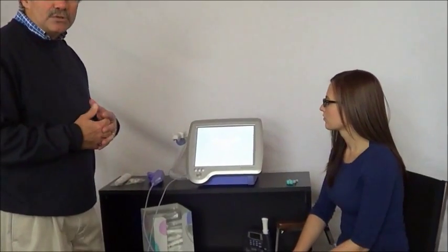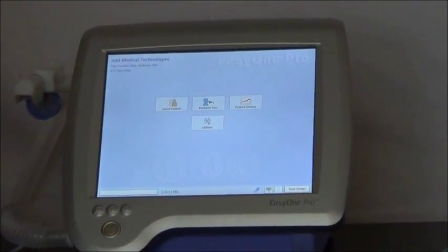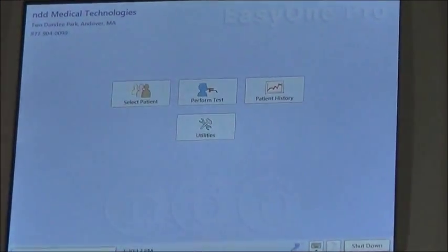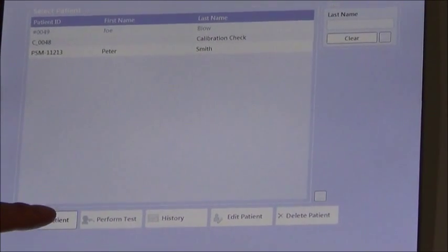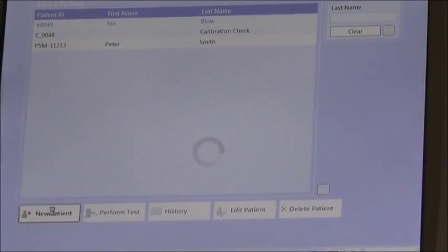The first thing we need to do to get started is to enter basic patient information. This is the main menu of the device, and to start the patient data entry, I hit 'Select Patient.' The patient may already be entered into the device, but if not, I need to enter them along with their demographic information. To do that, I press 'New Patient.'